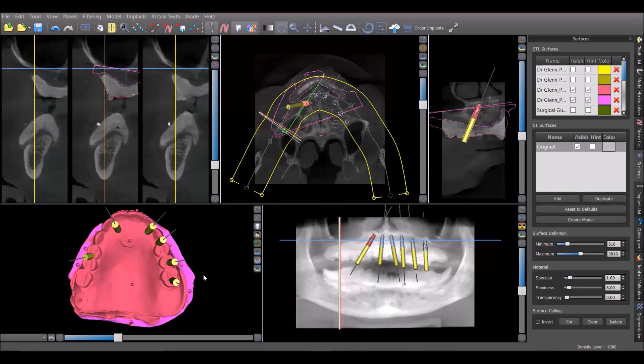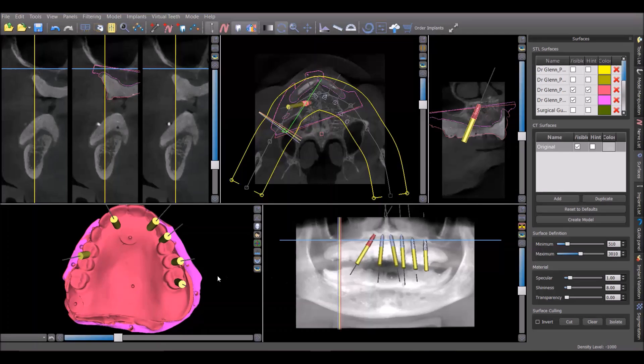The first thing you'll notice is the prosthetic emergence. You can see the implant emergence and this is the patient's denture. She was scanned with this denture in the mouth, and as you can see, we've got an emergence on all of these implants that comes through either lingual to the incisal edges or through occlusal surfaces, which is what we want for a hybrid denture.